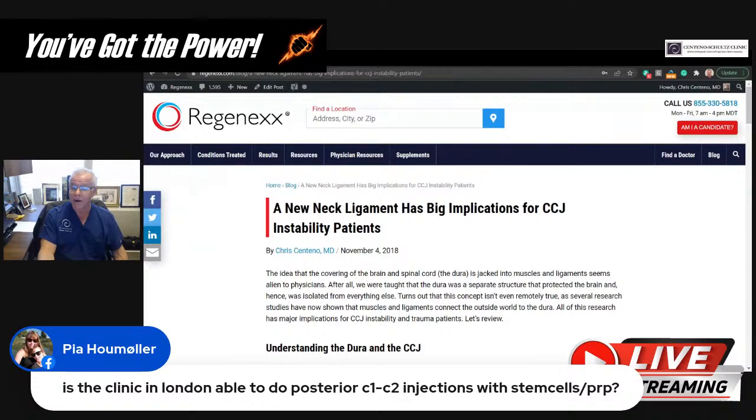And why would it matter? It matters because we have the vertebral artery there that goes and supplies blood to the back of your brain and cerebellum. So at the end of the day, getting into that artery and not recognizing that you're in that artery requires a digital subtraction angiography package on your fluoro machine, which is not usually found on spine fluoro machines because it's usually only bought and paid for, it's expensive, on interventional cardiology machines.